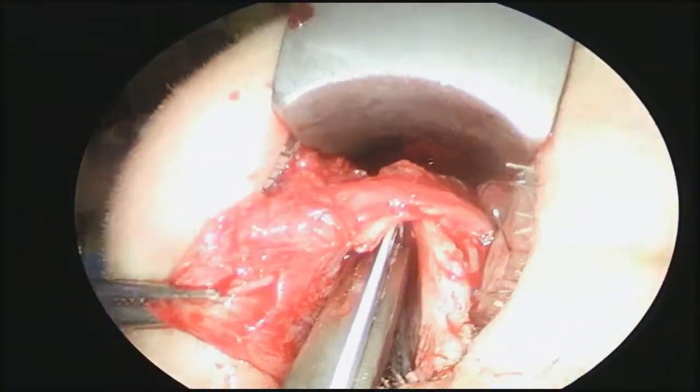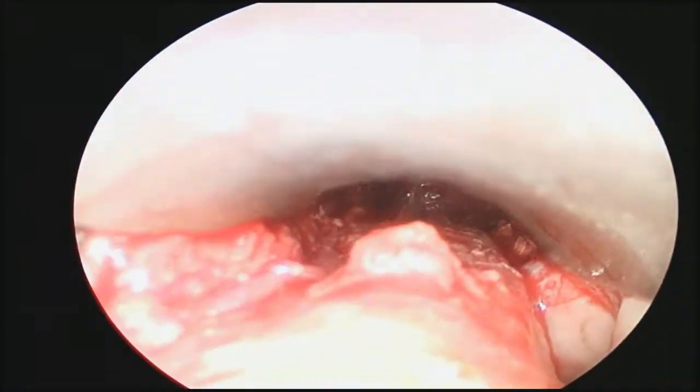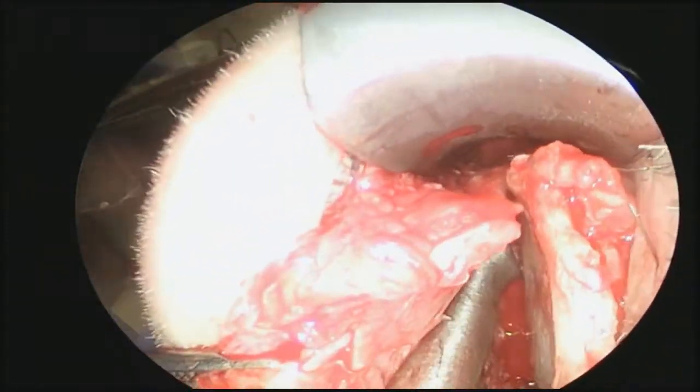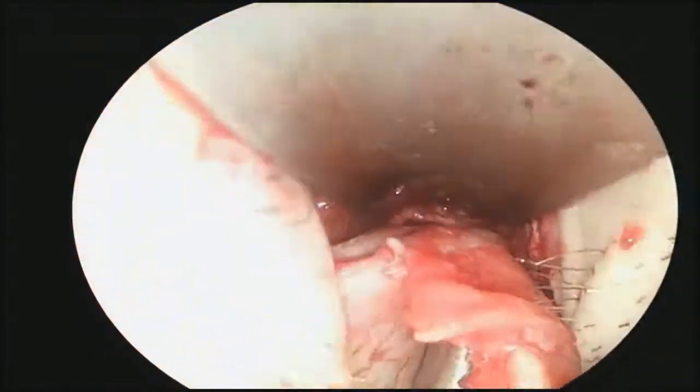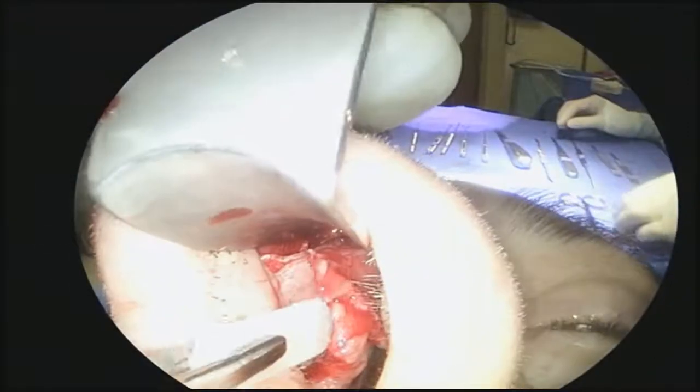We separate the upper lateral cartilage from the septum for better visualization. We demonstrate the same dilemma when placing the spreader graft under the intact left middle vault.